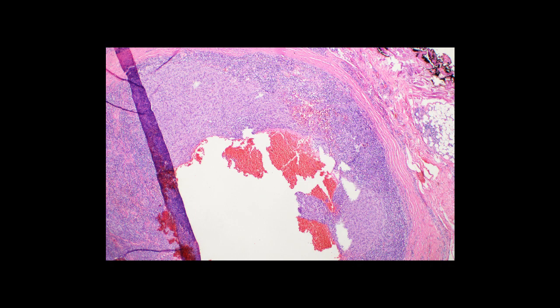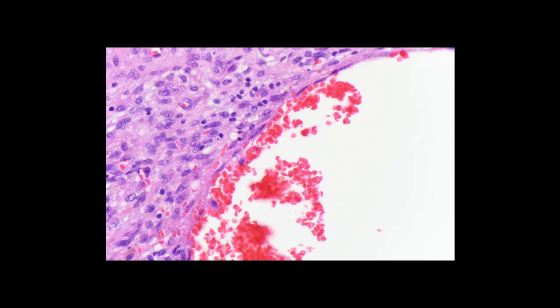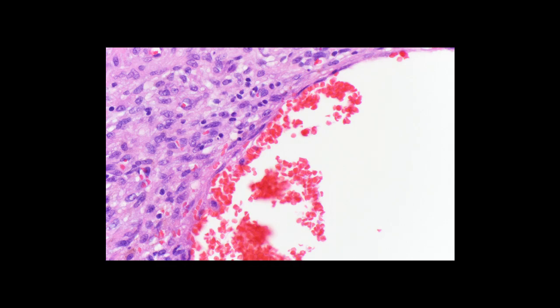Moving to another area of the tumor, we can focus on the central cystic space that is often filled with blood. At higher power, you can see that this space is lined by a flattened layer of tumor cells. These are not true endothelial cells — they are just flattened tumor cells — so this is a pseudo-vascular space and not a true vascular space.